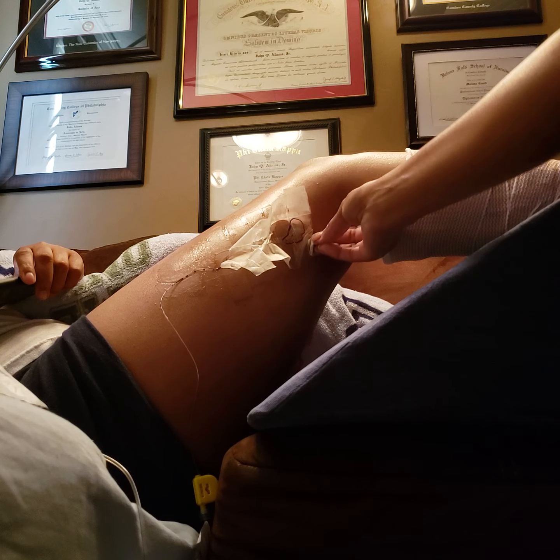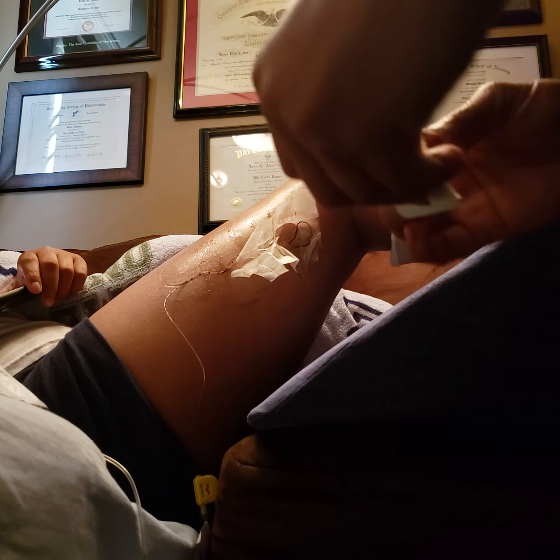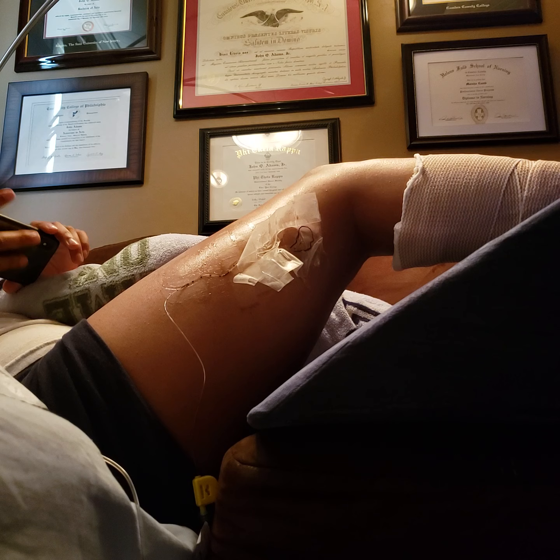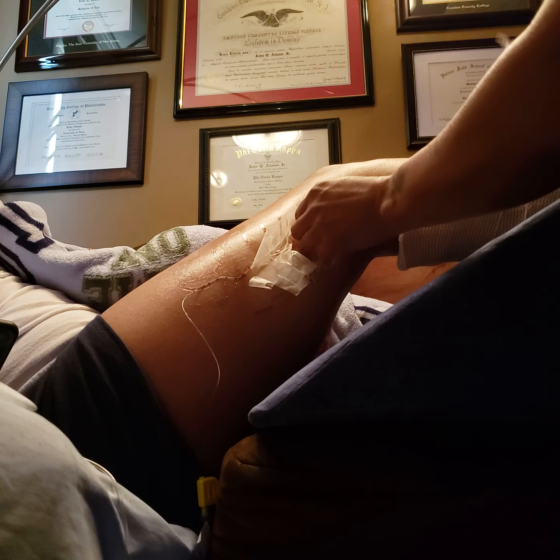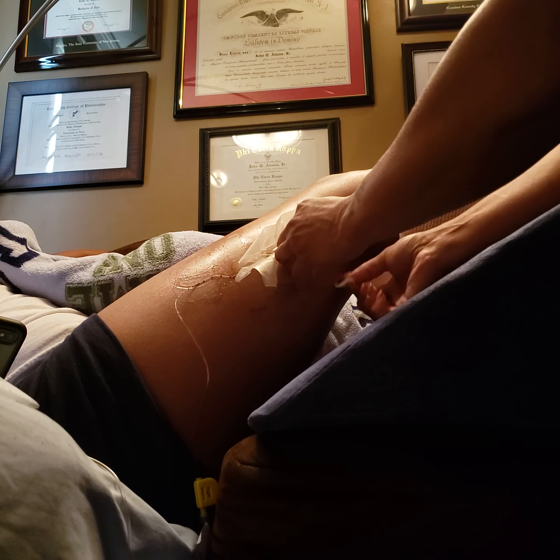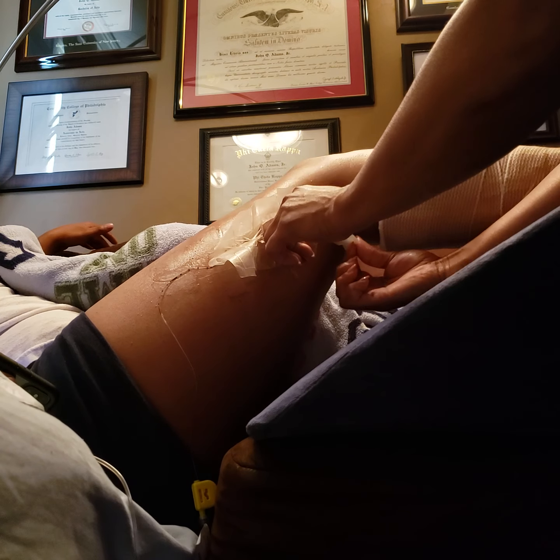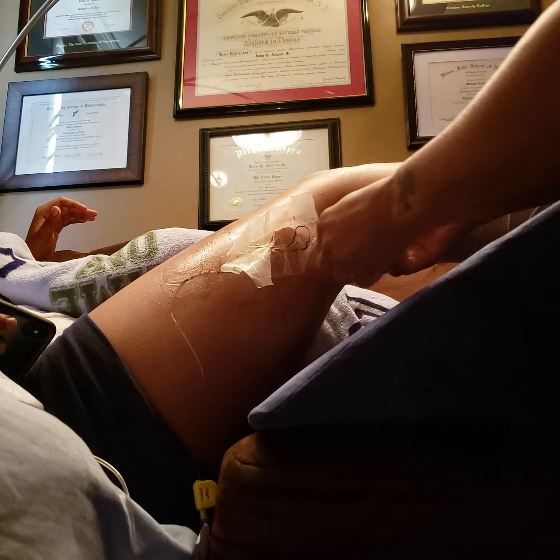There's something red here — it's not blood, it's from the tape. Oh, it ripped off my skin. Now they say once you remove the catheter there shouldn't be any bleeding, but I do have a band-aid just in case. I can't really see this part well because of the angle.